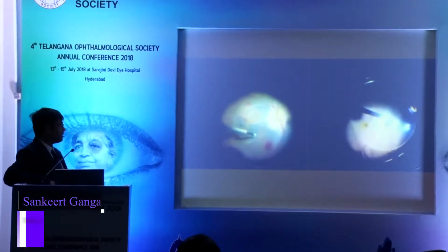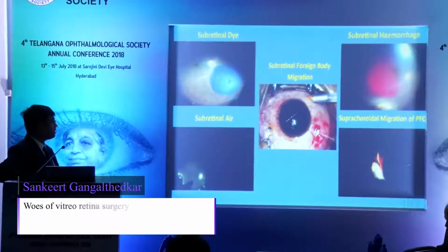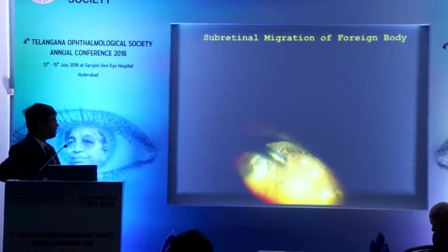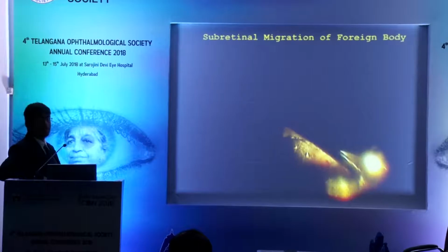We now present a compilation of these rare complications during vitreoretinal surgery and their management. This video demonstrates the subretinal migration of an intraocular foreign body.